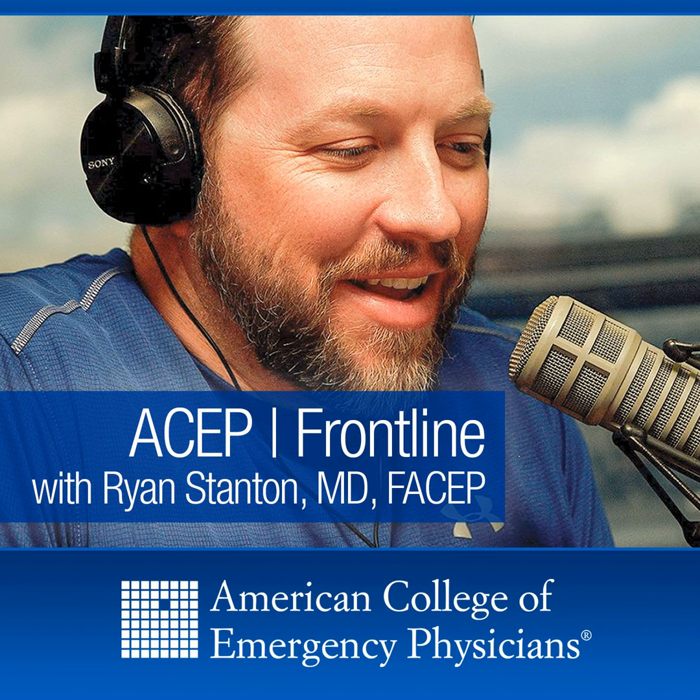So you mean monitoring like heart-wise or monitoring anything? Anything. I mean, the things that we can do. One thing that I like to do is to ensure that our chest compressions are adequate. I will a lot of times put the ultrasound down the femoral area and monitor the flow, follow the pulse wave. Making sure that everything looks good from there also lets me know where I'm looking. The pulse checks should be gone.